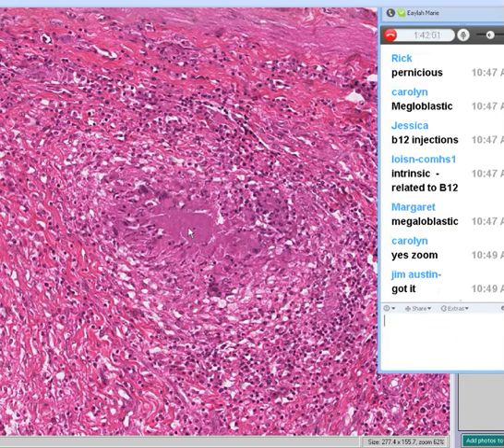Okay, good. So here's the nodule. You could see that in the middle of these nodules, there's no cellular detail at all. It's like it's necrotic. And in parts of these nodules, you could see cells that look like they have multiple nuclei within them, like over here, and like over here, and like over here.